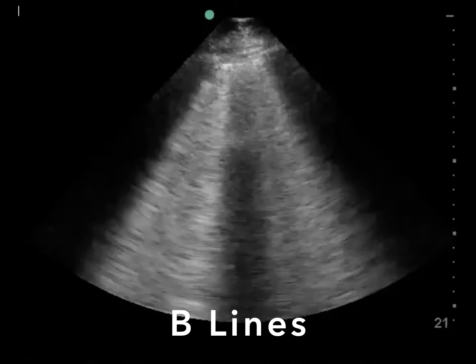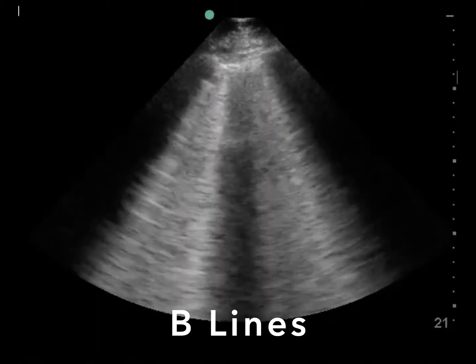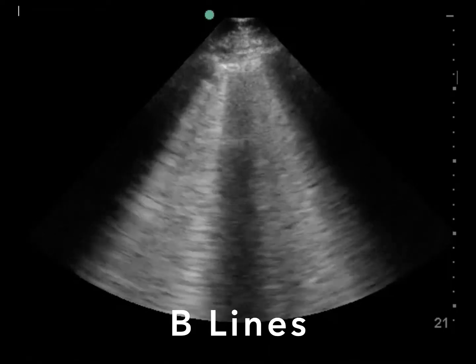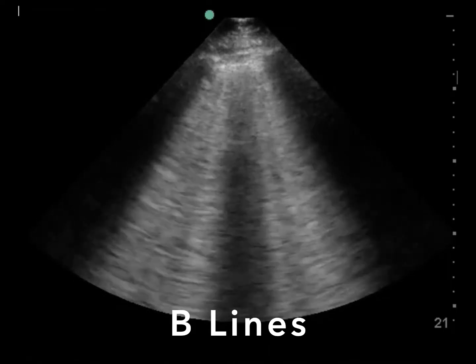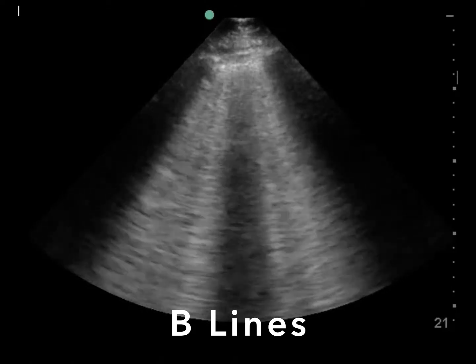Let's start learning more about sonographic lung pathology. B-lines are bright white vertical laser-like lines that start at the pleura and extend vertically all the way down the screen to at least 14 to 16 centimeters deep. They move with the movement of the pleural line, and they obliterate A-lines. B-lines are an artifact that represent thickening of the interlobular septa and are a sonographic representation of alveolar interstitial syndrome.